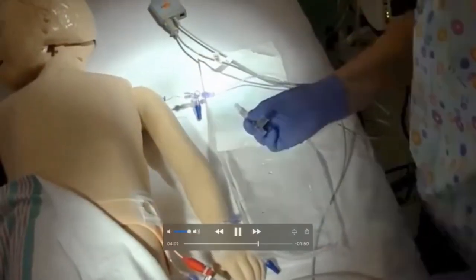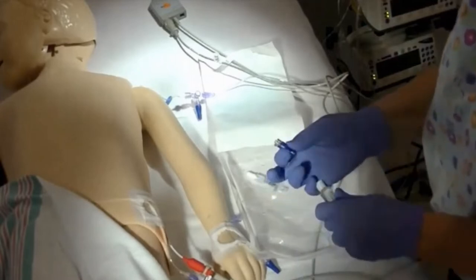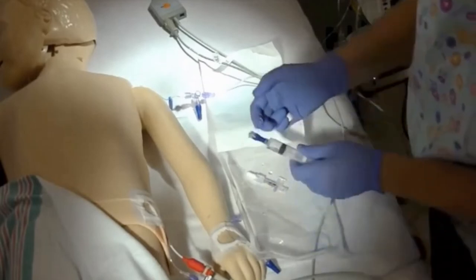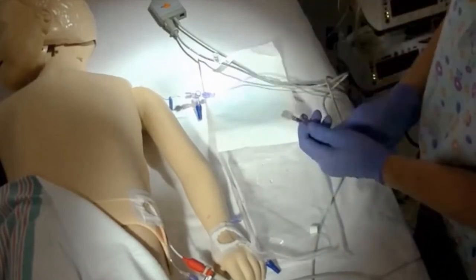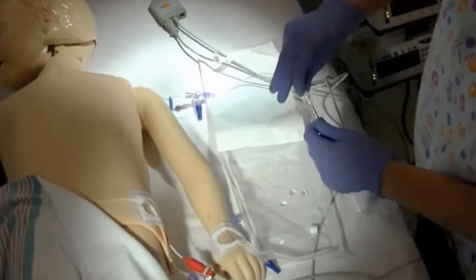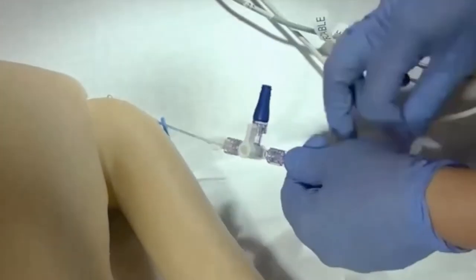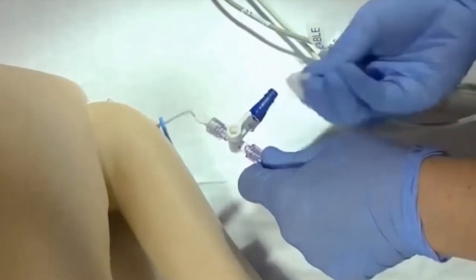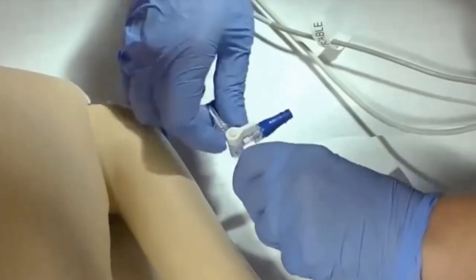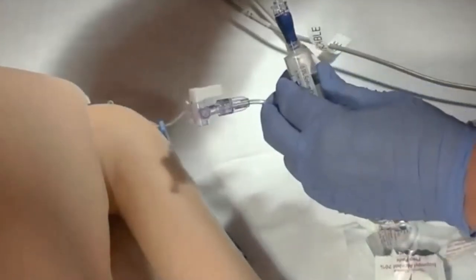Find the injectate temperature sensor housing from the PiCCO arterial line transducer package. Prime a needleless access cap and connect this to the injectate temperature sensor housing. Finish priming this setup. Clamp the distal port of the CVL, disconnect the CVP transducer setup, and reconnect on the side port of the stopcock. Now connect the injectate temperature sensor housing on the end port of the stopcock.